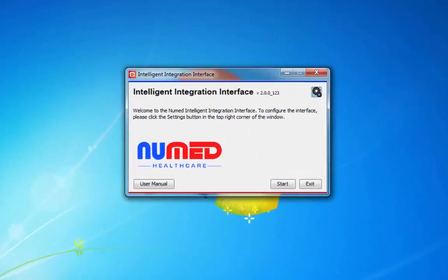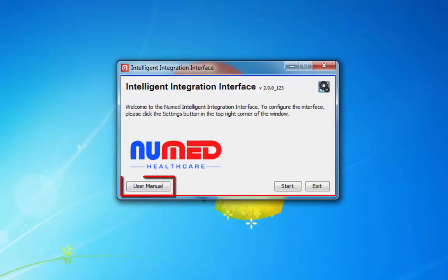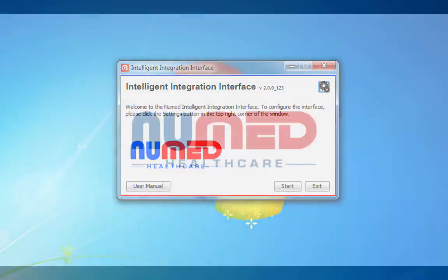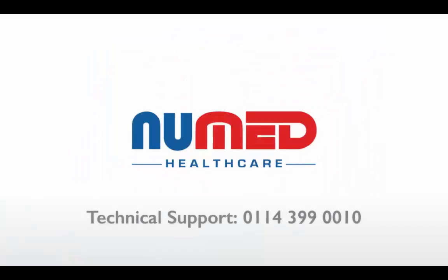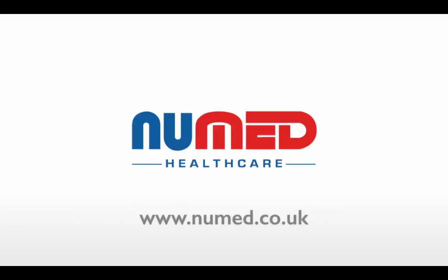More information about the integration software can be found in the user manual, which is accessible from the button on the welcome screen. This concludes the training on the product use. Separate videos are available covering subjects such as calibration verification, cleaning, and battery fitting and removal. If you need any more information on how to use the SpiroConnect system or integration software, please contact our technical support team on 0114 399 0010 or visit newmed.co.uk.